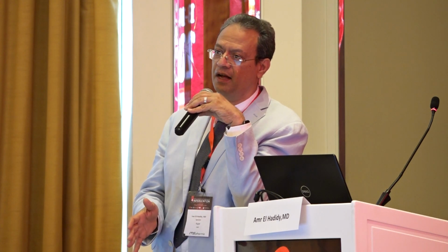We know all that. It's very difficult for most of the countries in our region, as it's very costly. So I think if you plan the case well, as we mentioned, you don't need to do the case in the same setting of the angio, because you need to study it. You may see other collaterals, and maybe a septal one you could not see, you see an epicardial one, a straight one. You can see antegrade options, very nice, and you can finish the procedure in half an hour.